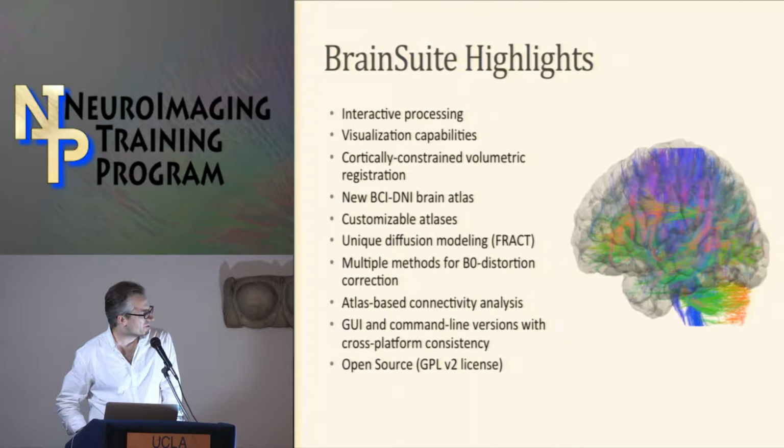Finally, we are open source as well, which I think is important in terms of the movement toward open science and open methods. You can actually look at the code if you want and see exactly what's going on, as well as develop from it yourself if you would like to do that.